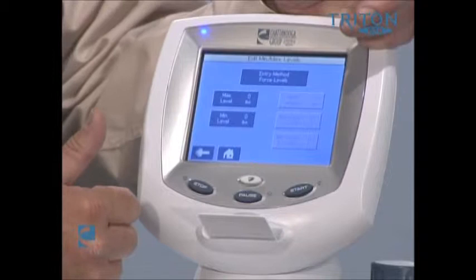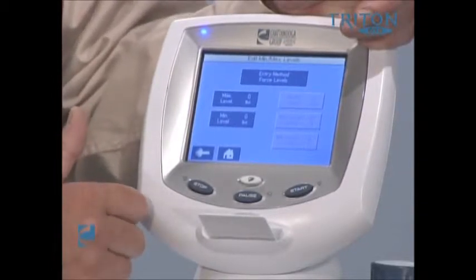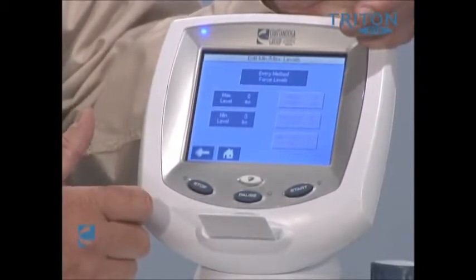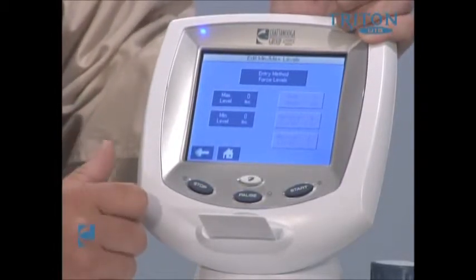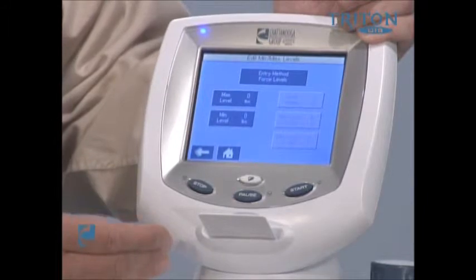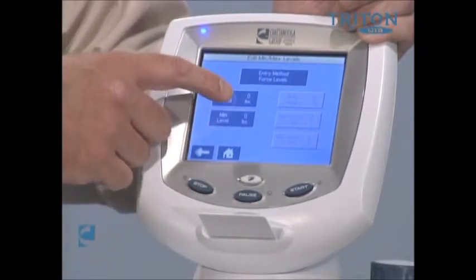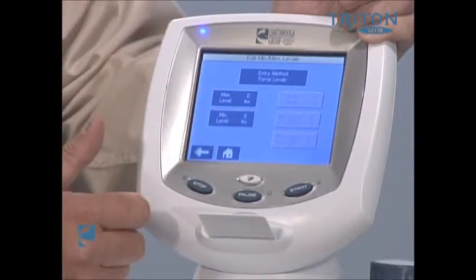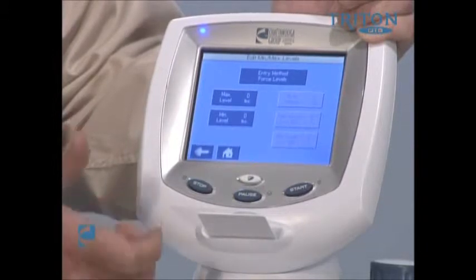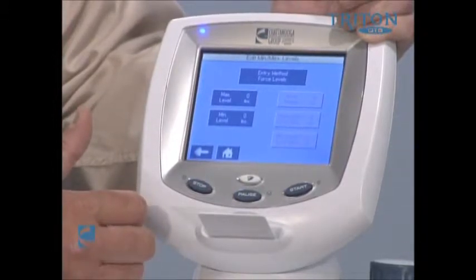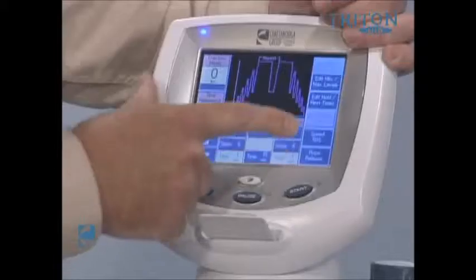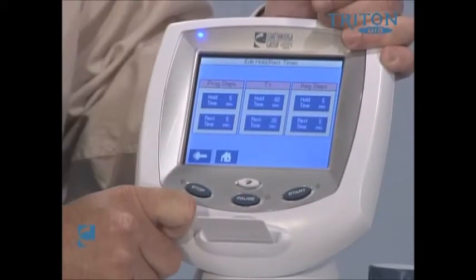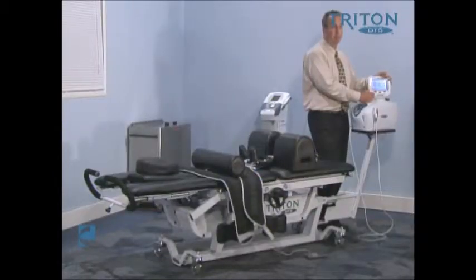For intensities, if we're doing a static treatment then there's only going to be one intensity, however we can manipulate that to meet the needs of the patient. When we're doing intermittent or cycle traction, we can set the max and the min level — so we can set the higher intensity and also set the lower intensity based on the patient presentation and our particular protocols.